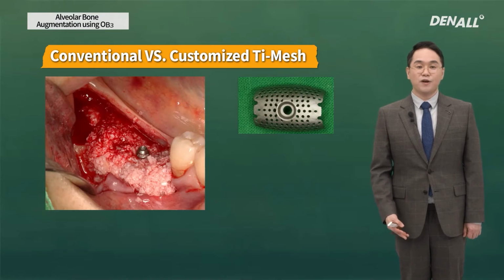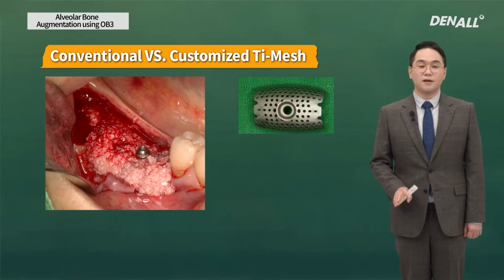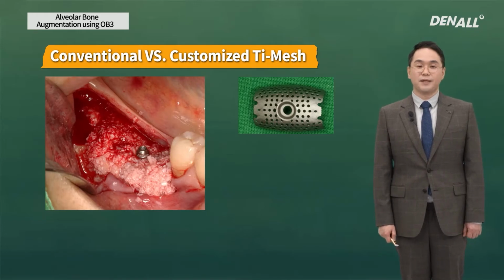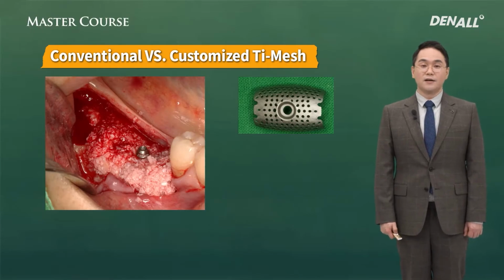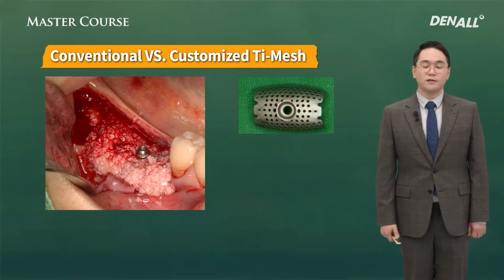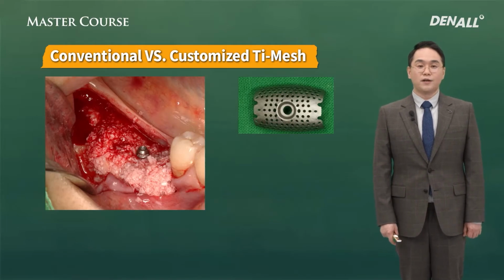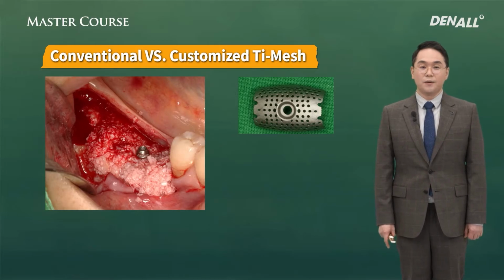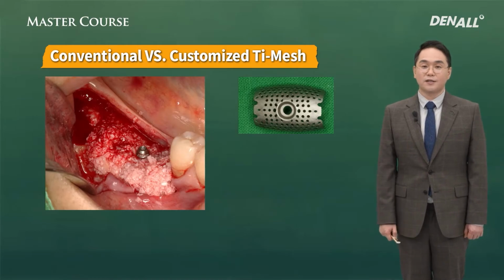So first the lingual flap is dissected and the site is covered with the bone graft material and tenting screw is positioned. Autogenous bone and xenograft are mixed together. This is unlike the previous case. Vertical augmentation type Jawbuilder is used, which is 20 millimeters mesiodistally because the defect area is long mesiodistally.